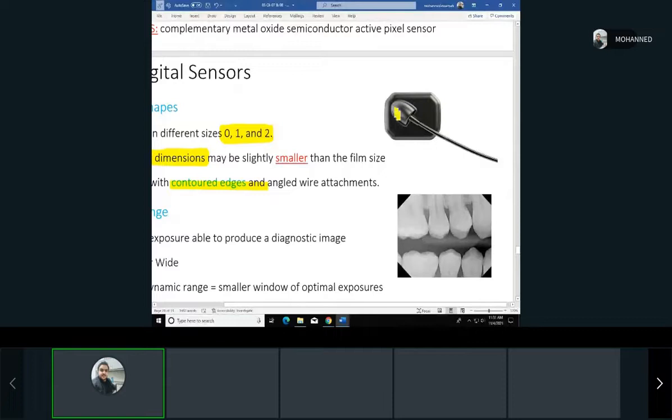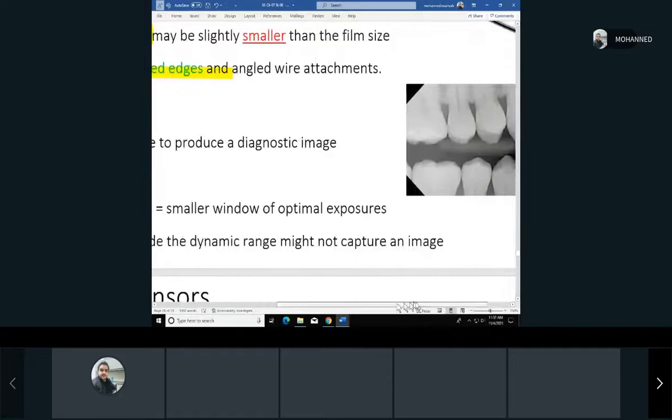Yeah, I was there when they were doing the presentation to us and Hygiene, and they said they're patenting it, or they got a patent for the wire placement that is diagonal. It's just because they say it's much easier, it would not produce more wire problems. And still it gets us what we want to see.